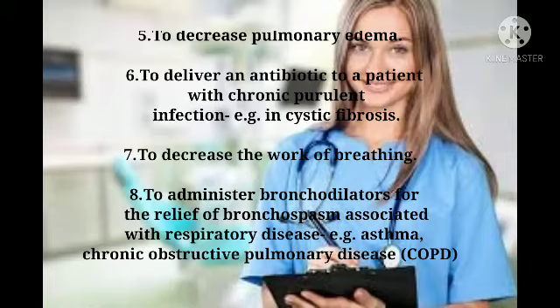to decrease the work of breathing, to administer bronchodilators for the relief of bronchospasm associated with respiratory diseases, for example asthma and chronic obstructive pulmonary disease or COPD.